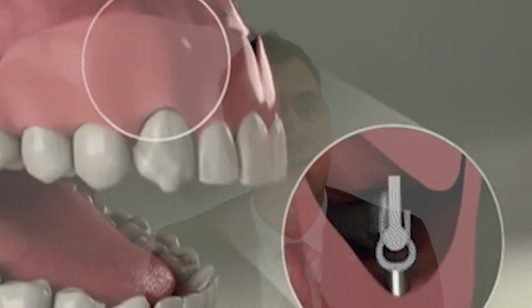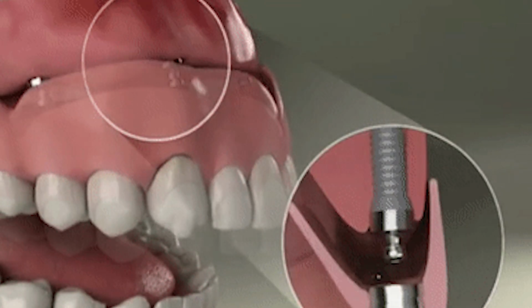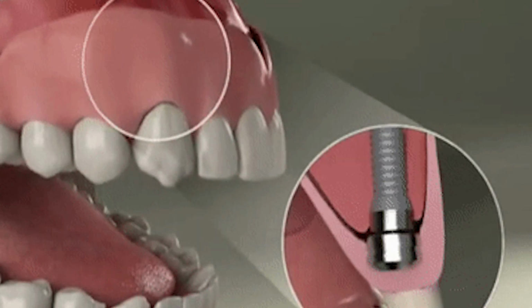Remember, we have to be able to take them off. It can't fit so tightly on there that we can't remove them, which means that with enough bite force, you'll accidentally pop them off. Most people that have these types of appliances are well aware of this problem. They'll take a bite of food and bite down on the right side, and because they're compressing on the right, the left will disengage or pop off.